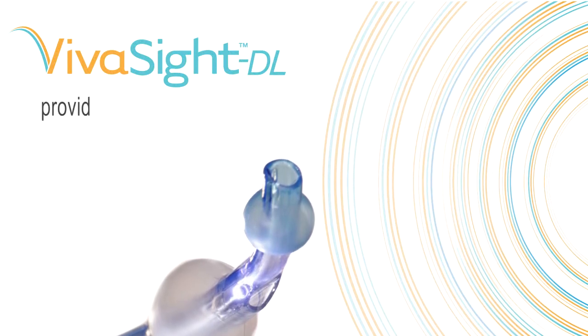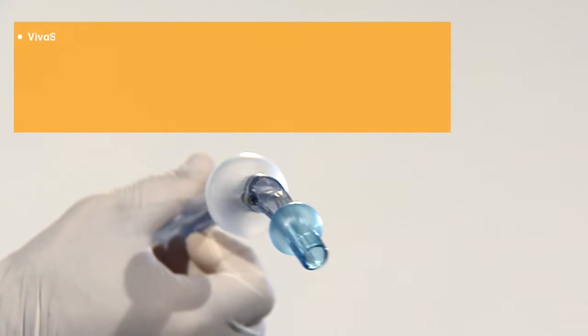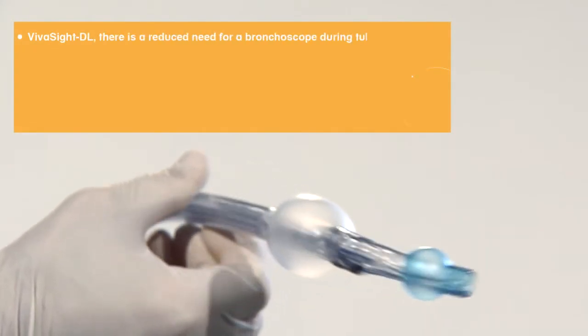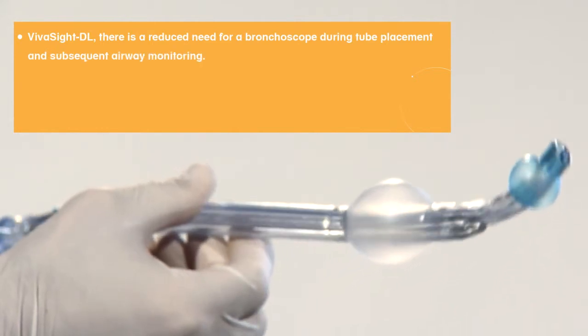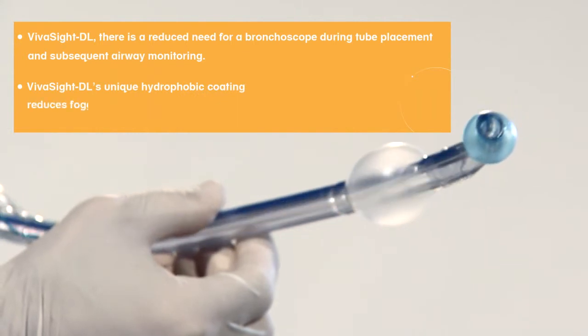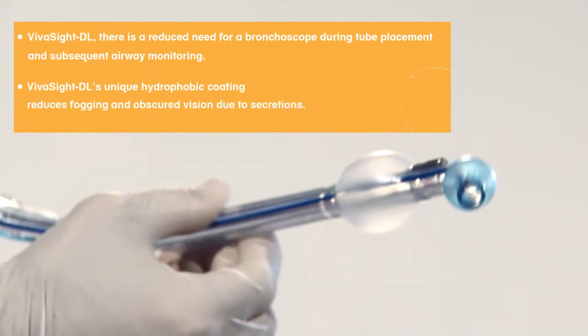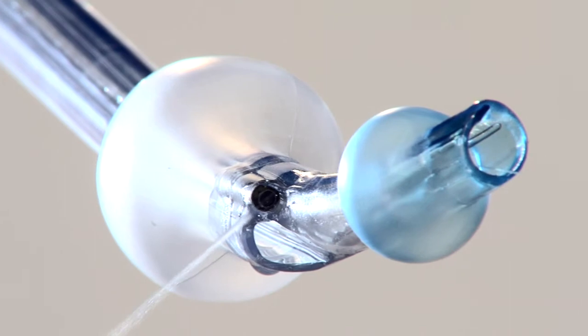VivaSight DL provides the surgical team with outstanding capabilities in airway management. With VivaSight DL, there is a reduced need for a bronchoscope during tube placement and subsequent airway monitoring. The VivaSight DL's unique hydrophobic coating reduces fogging and obscured vision due to secretions. The integrated flushing system enables quick, efficient cleaning of the camera lens in situ.